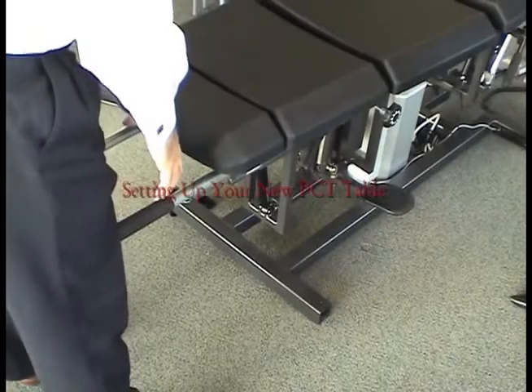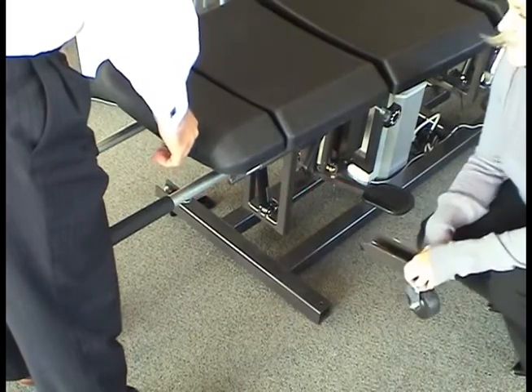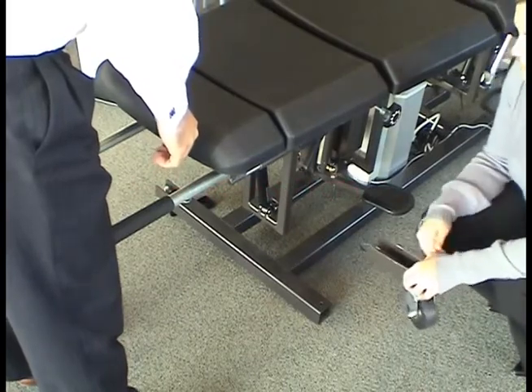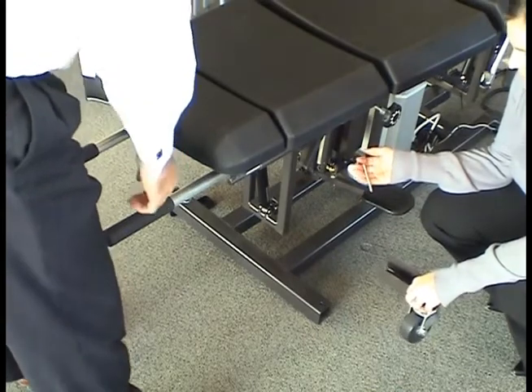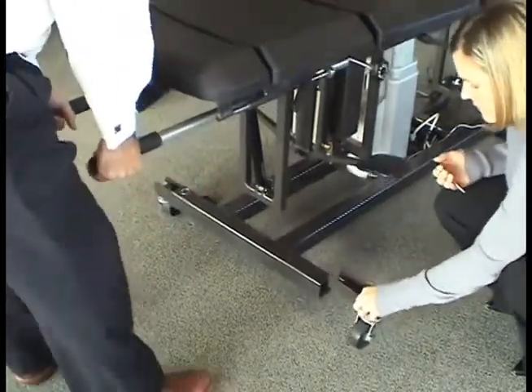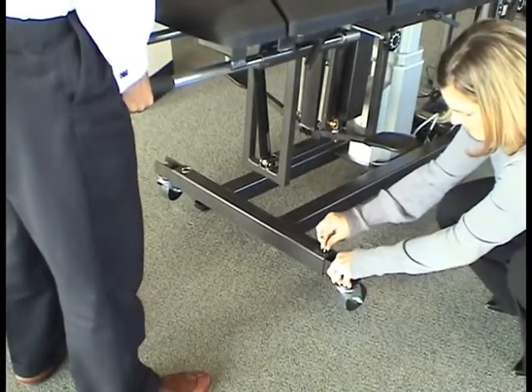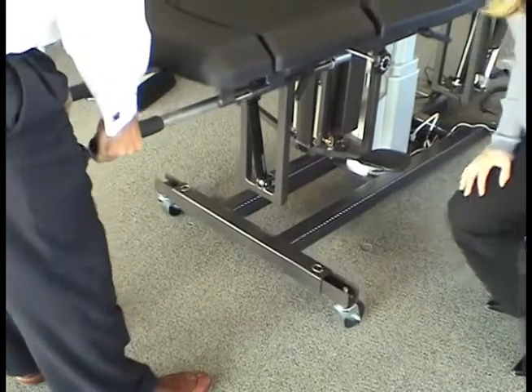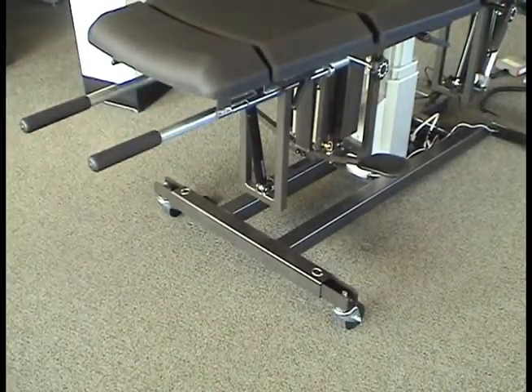Setting up the table. The easiest way to move the table is on its wheels. The wheels and the locking wheel pins are found in the cardboard box. With one person lifting an end of the table, a second person can insert two wheels and lock them with pins. Repeat this process on the other end of the table, and the table can be wheeled into place.